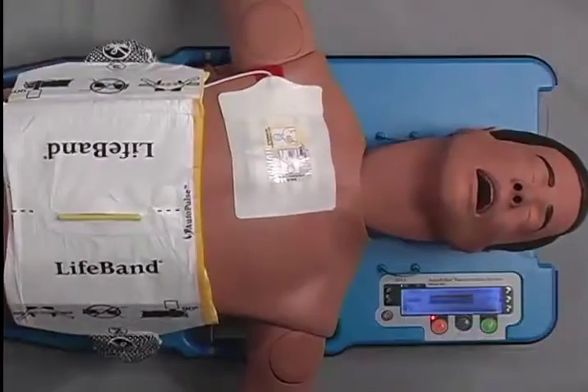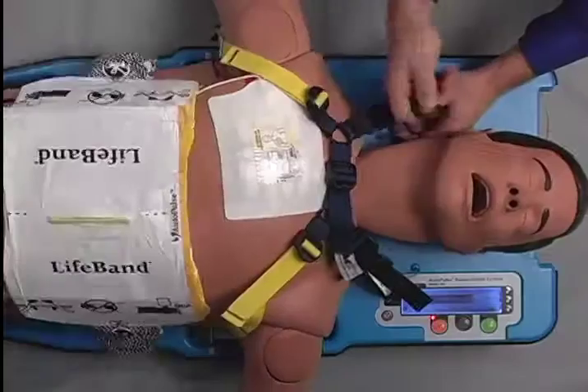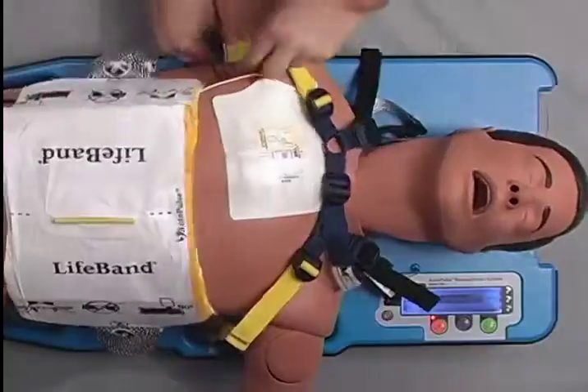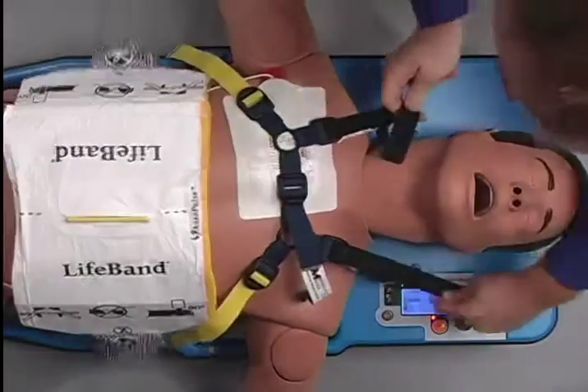To apply the shoulder restraint, clip in the black straps to the loops near the patient's head. Clip in the yellow straps to the pin next to the yellow line on the platform. Adjust into position as needed and then partially tighten by pulling the yellow ends first.